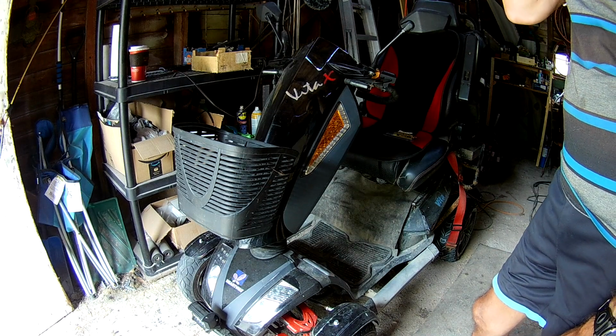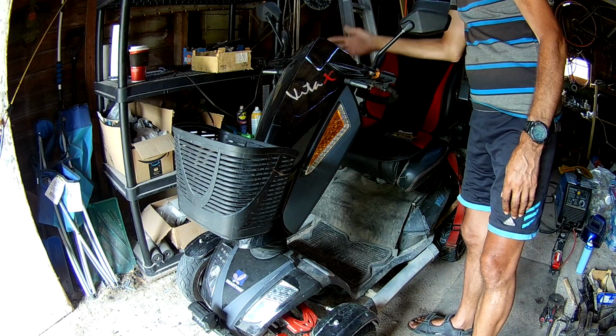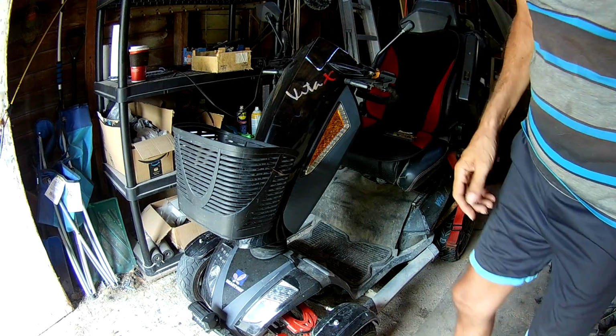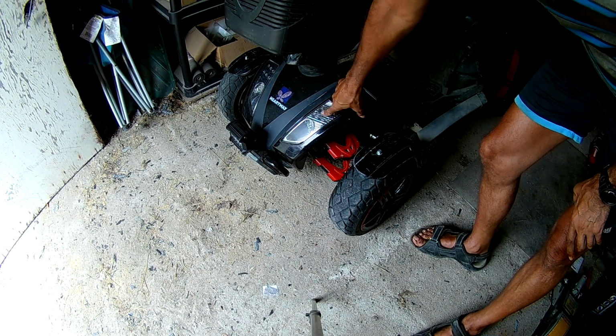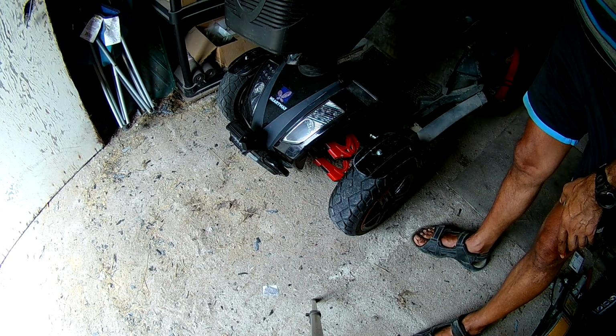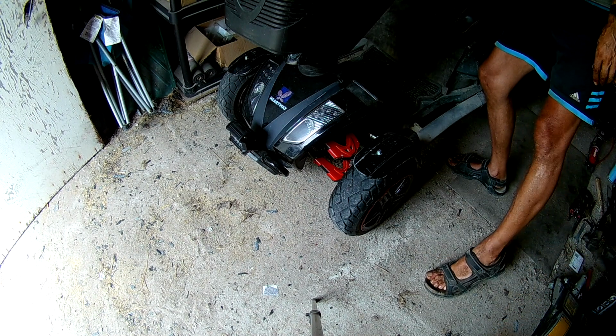So I got thinking. When I put my orange lights on, everything's supposed to be on except for the headlights. So these are supposed to be on. These are supposed to be on. They're not on. So there's a problem somewhere.